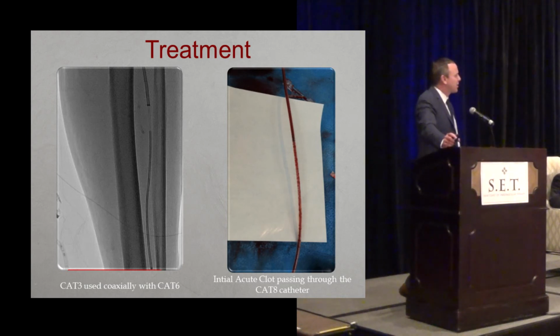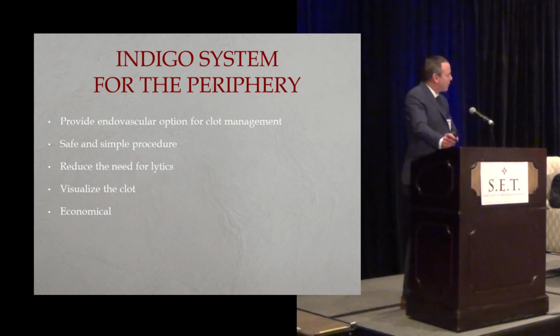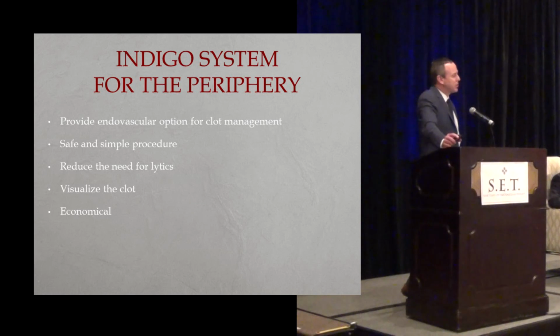So in conclusion, the Indigo system for the periphery is a very nice endovascular option for clot management, whether it be thrombus or acute emboli. It's a safe and simple procedure, and overall reduces the need for lytics, and you can actually visualize the clot.